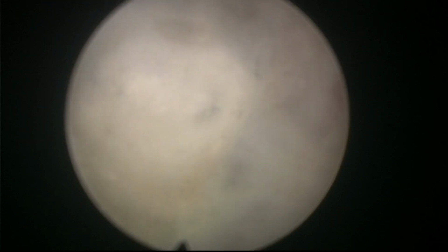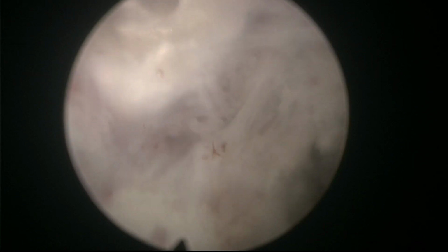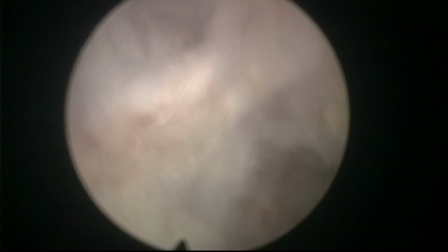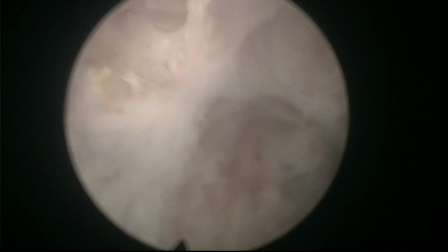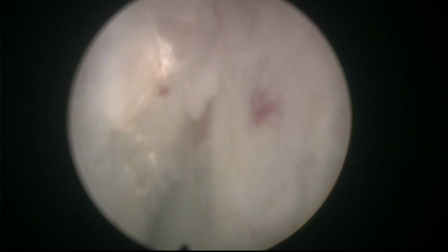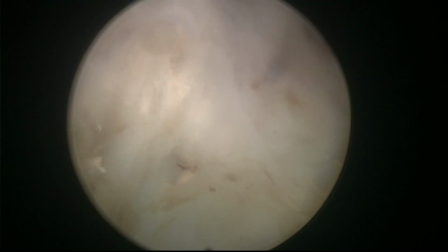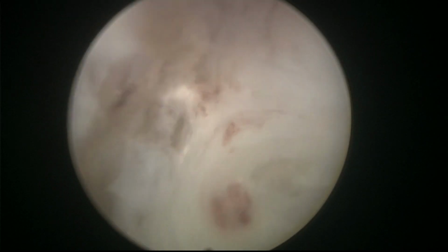Here you see that the posterior plane was a little bit deeper than the lateral plane. That's why we had to come out a little bit, and that's why you have to try to carry a uniform depth in your dissection. So don't get carried away with one side, anterior or posterior. Try to go around several times, developing the plane and trying to follow the best possible plane.